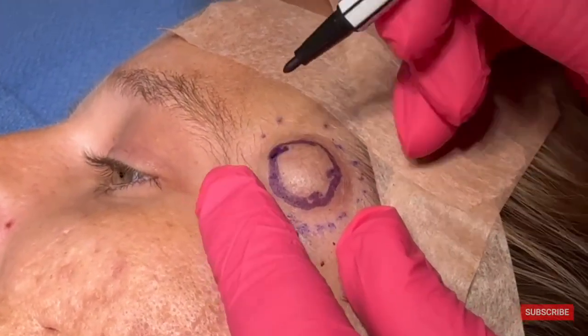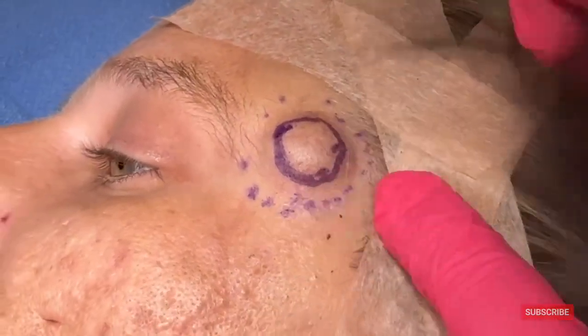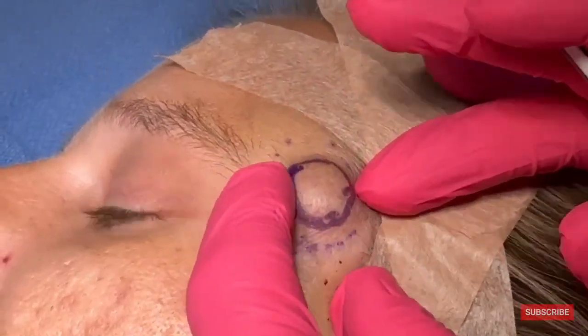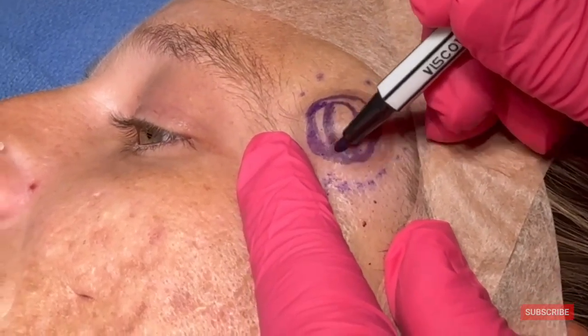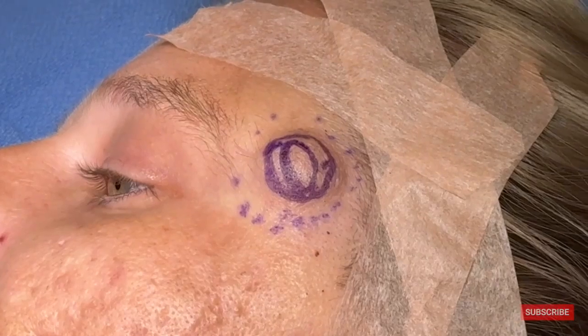So if you look, this is the boundary, then you decide, okay, how tall is the cyst? How much skin is lifted forward? And then you decide how much skin I need to remove so it looks good on day one. Because you can remove it, leave the skin, and it will shrink, but it will take a while to shrink properly. The next trick is a little bit of lidocaine or a little bit of fluid.